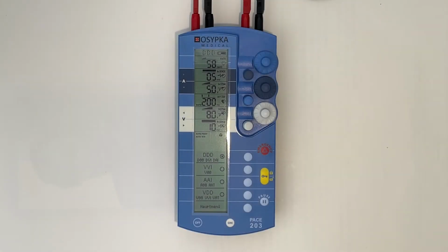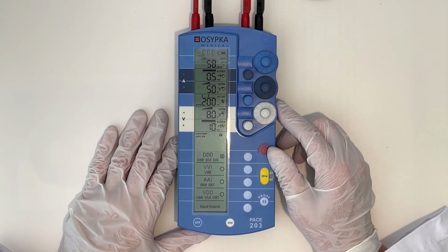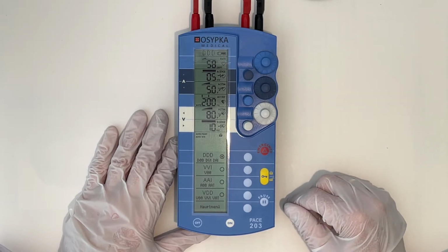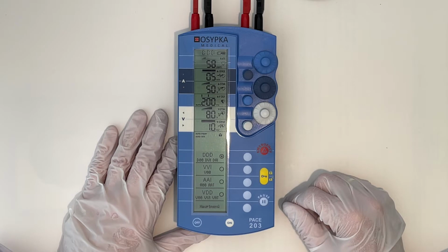The impedance check on the PACE 203 is a useful parameter to have when looking for sources of error, particularly at the moment when the heart wires are placed in the heart muscle and then connected to the device for the first time. If, for example, the stimulus thresholds are very high or if the sensing is unavailable, then there's often a discussion between the cardiac surgeon and the anesthesiologist about what could be the cause.